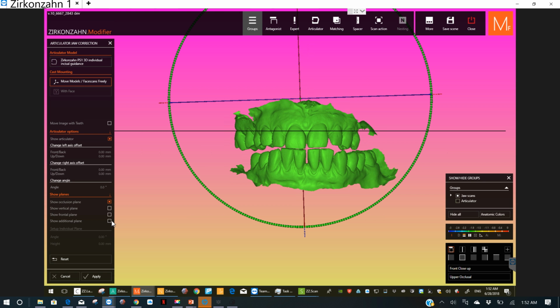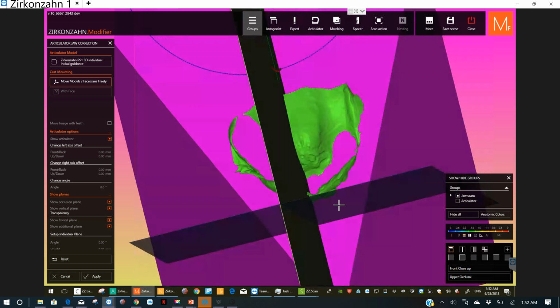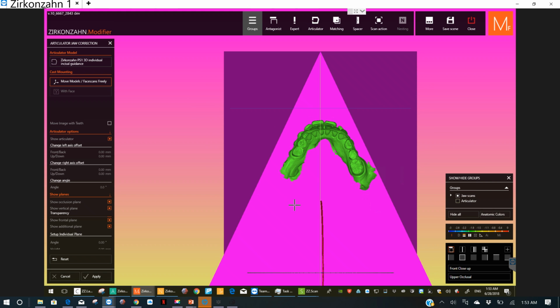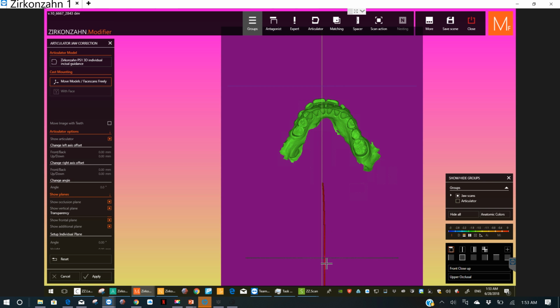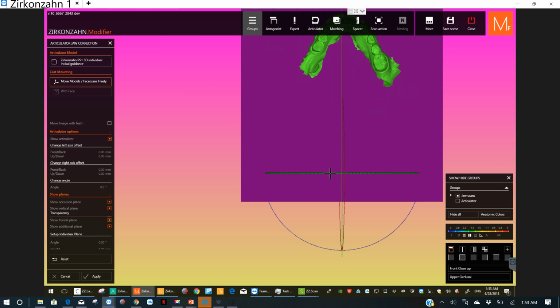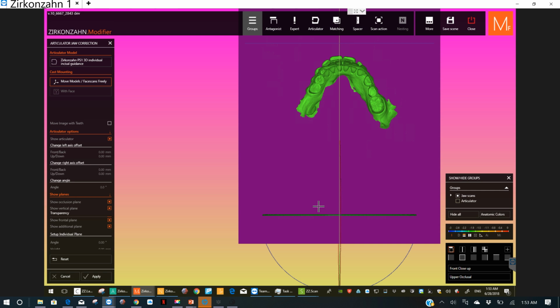I like to turn on these planes right here. They make it easy to see how you're doing, and then see how it gets all crooked when you don't look at stuff the right way. So I'm holding down Control to make things disappear, and I wheel click in to center it. So this is probably the most annoying part of the whole thing, just getting this lined up. But once you do, then everything else will be super easy.